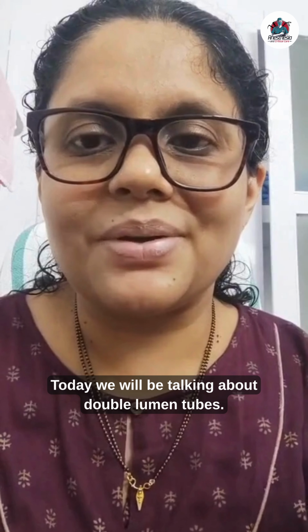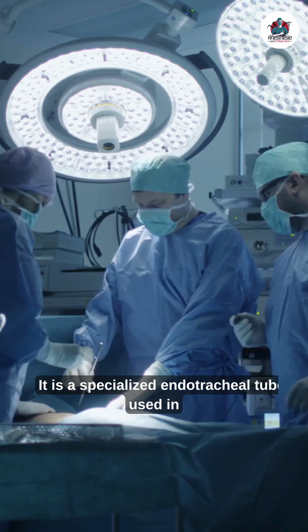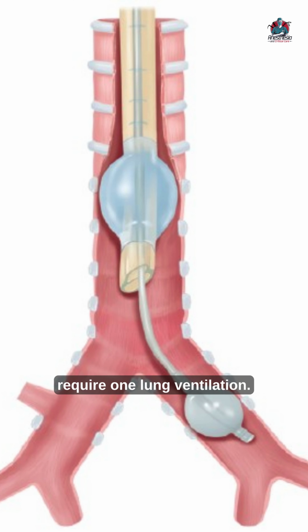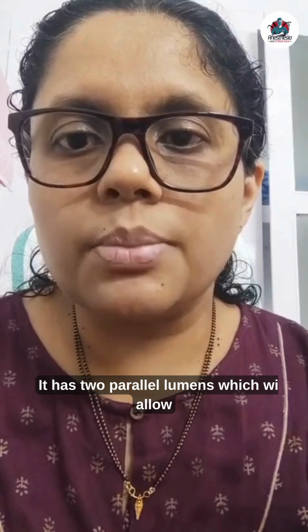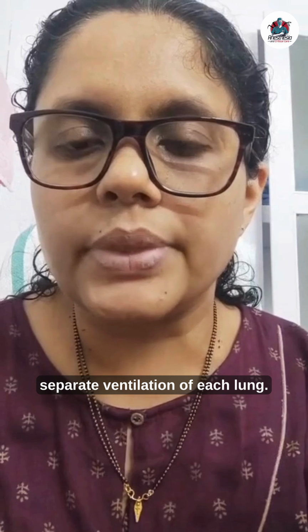Morning. Today we'll be talking about double lumen tubes. It is a specialized endotracheal tube used in cardiac and thoracic surgeries where you require one lung ventilation. It has two parallel lumens which will allow separate ventilation of each lung.